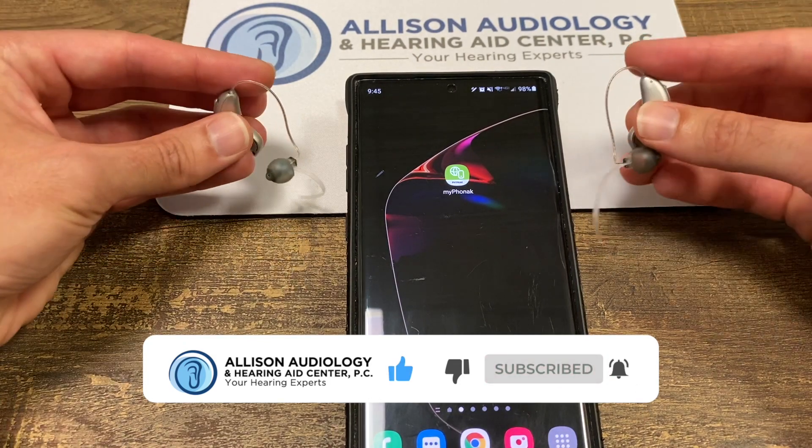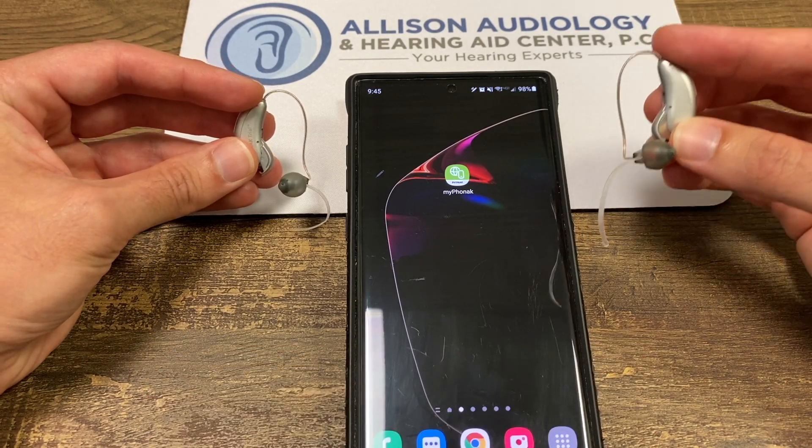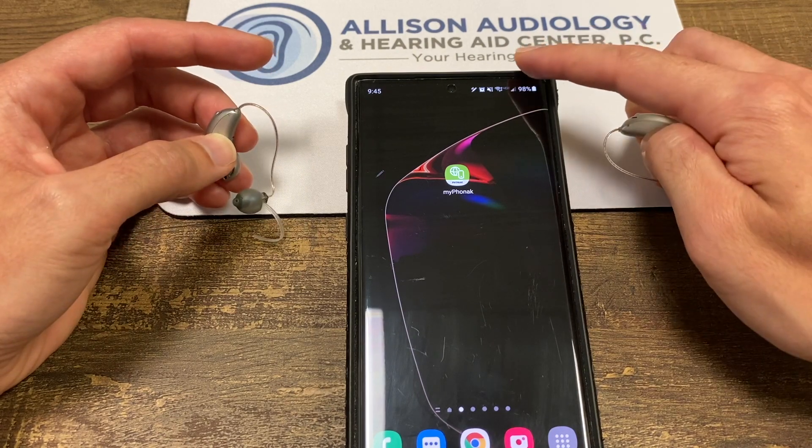Typically the main hearing aid, the default, would be the right hearing aid. So we would pair the right hearing aid to the phone using standard Bluetooth.